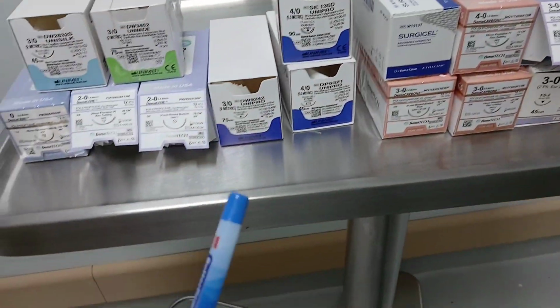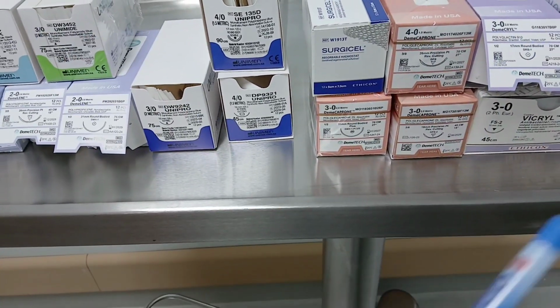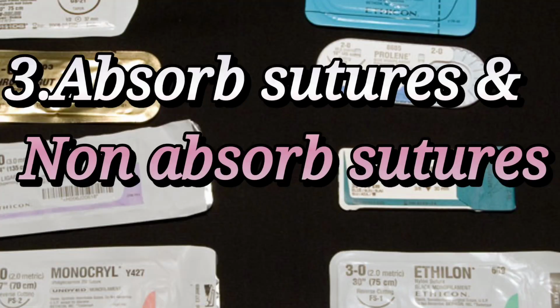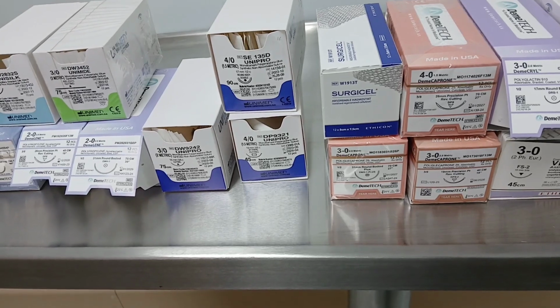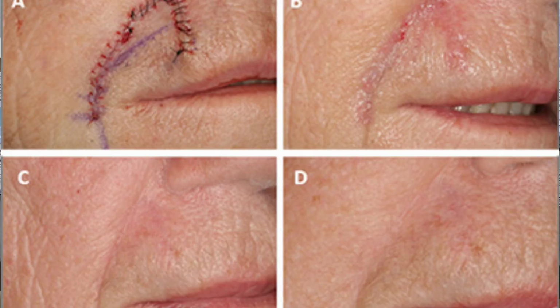So second, our heading is available sutures, which I have got ready for the explanation. And third we will see what is the absorbed suture and non-absorbed suture. We have two types of sutures, absorbed and non-absorbed. What is the meaning of absorbed? Absorbed means the suture material is automatically absorbed into the human body.